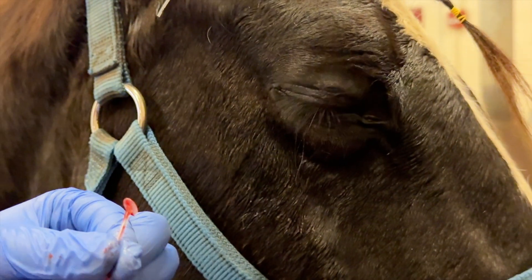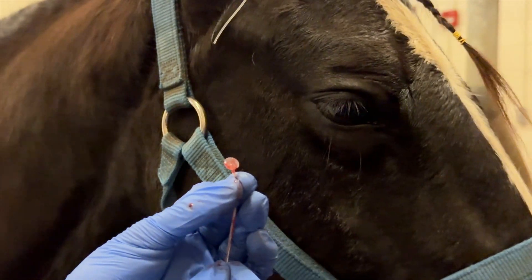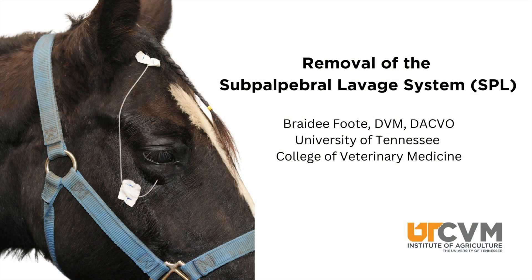There will normally not be any blood on the tube, but there is in this instance because it was just placed for demonstration purposes, so it is a fresh wound.